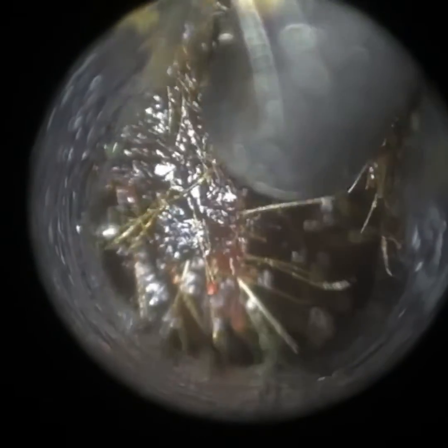It's a bit more tricky if you're doing the left ear, because sometimes the cartilage at the back of the entrance of the ear canal can flap over the tip of the endoscope when you push it in the opposite direction — so when you look in the ear, you can't see the tip. That's when you have to use the instrument to stretch the cartilage up and off the tip of the endoscope to get it in view before inserting the instrument over the top. It is quite a challenging skill to acquire as it requires a lot of hand-eye coordination and bilateral integration, and many specialists find it challenging.